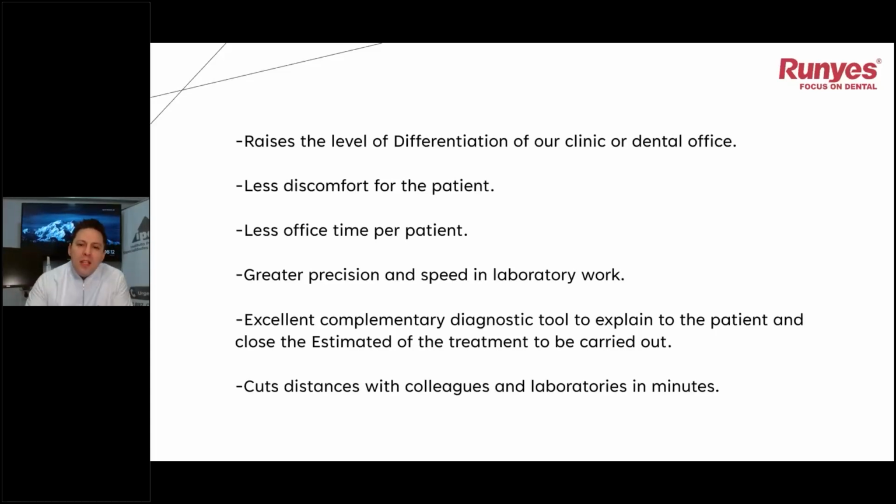And with our patients, it's amazing how it absolutely changes the way that they see you when you scan their mouth, and you explain to them, rotating their mouth in 3D live, and you can tell them with precise detail absolutely everything that is going on in their mouth.